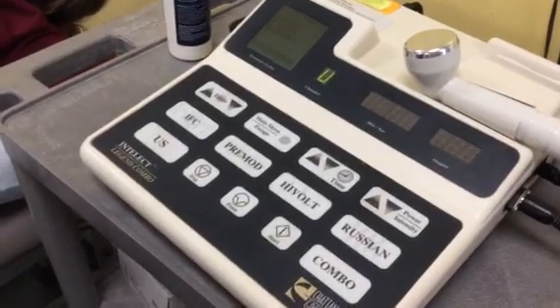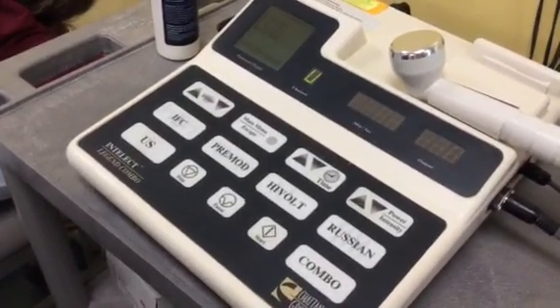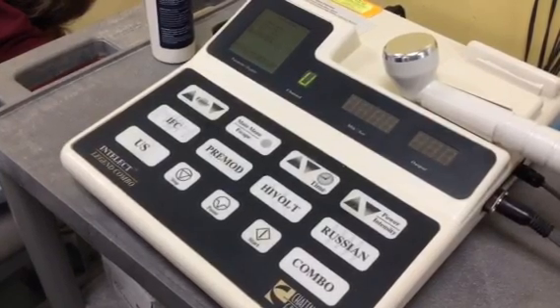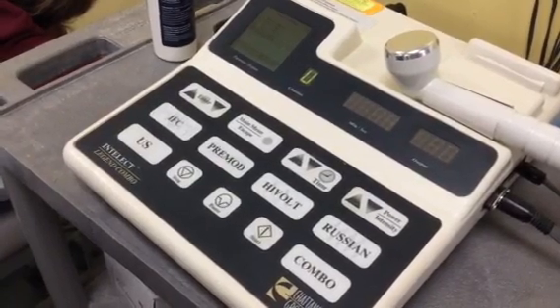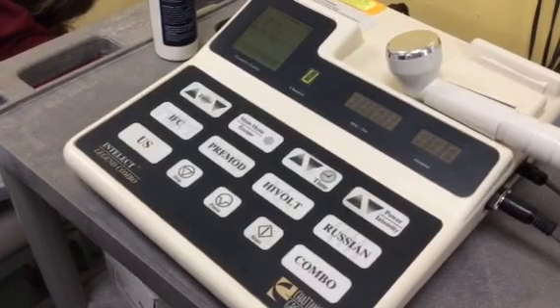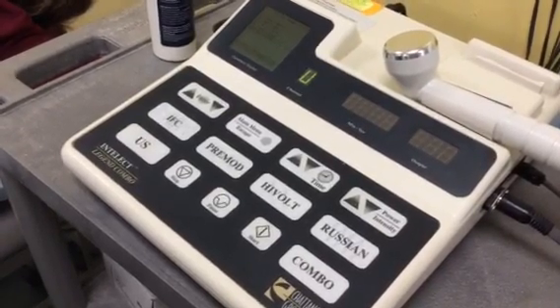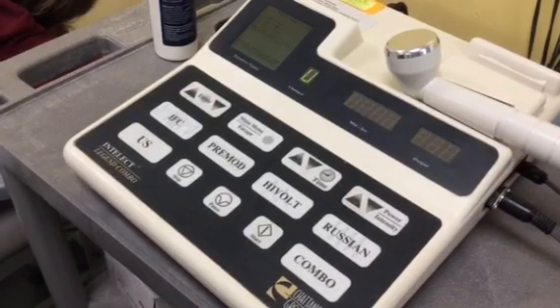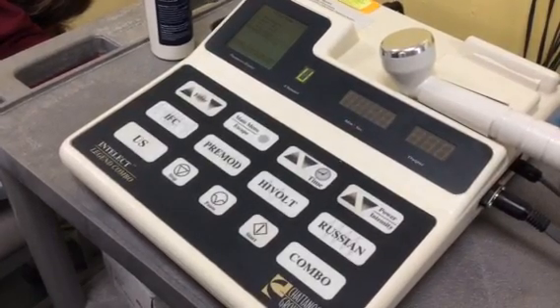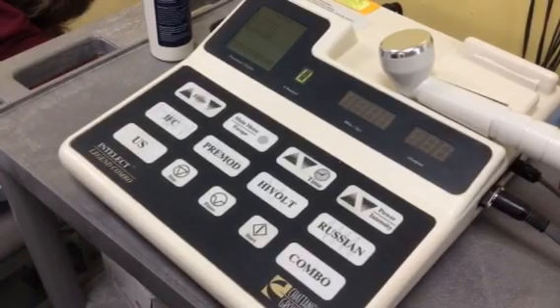In this video we're going to talk about therapeutic ultrasound. For it to be therapeutic ultrasound, it has to be in a frequency between 0.7 and 5 MHz. In most clinics we use ultrasound that's either at 3 or 1, depending on the depth of the tissue we're trying to treat. 3 is going to be more superficial tissue and 1 is going to be deeper tissue.